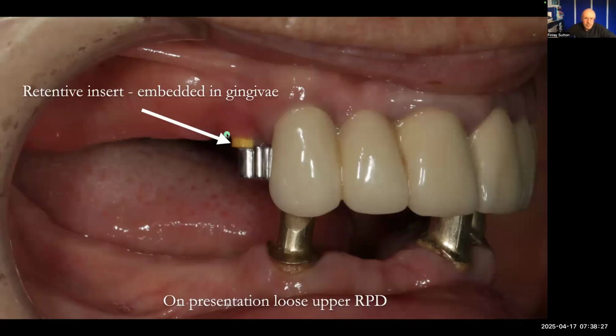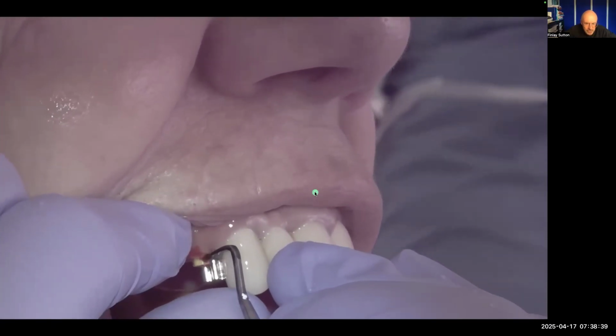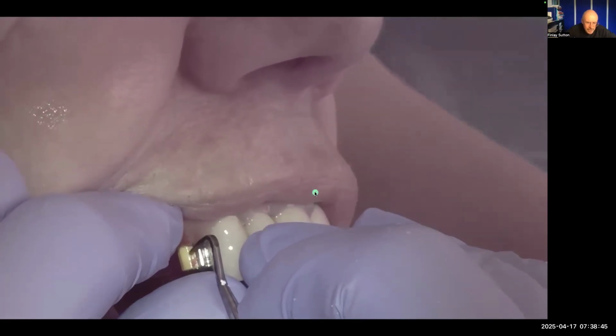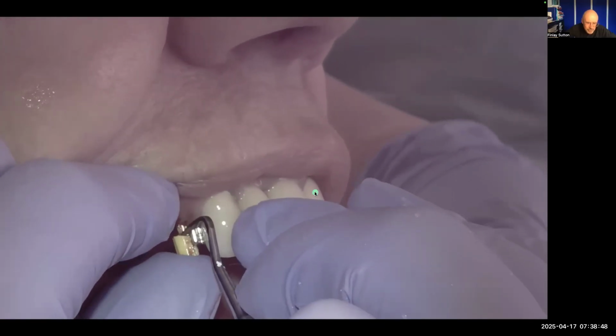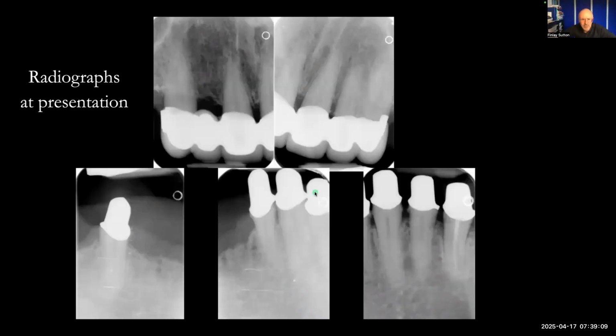So anyway, what I did at this visit was I popped a little bit of local anaesthetic in there, and then just lifted this out. Just got a flat plastic on it, and got that attachment out there. Gosh, that must have been so uncomfortable for her, because I had a little piece of, I think a little nut or maybe a seed that just got stuck here for a few weeks ago, and it was terribly uncomfortable until I just got a scaler and got it out. So these things must really be a little bit uncomfortable.